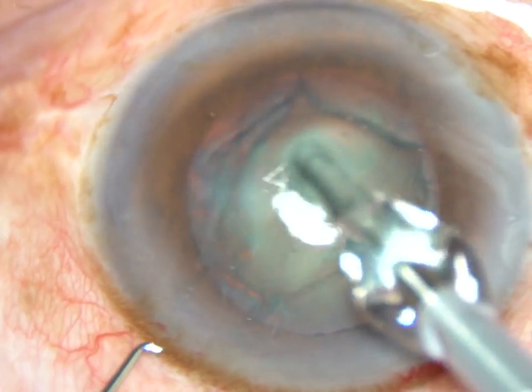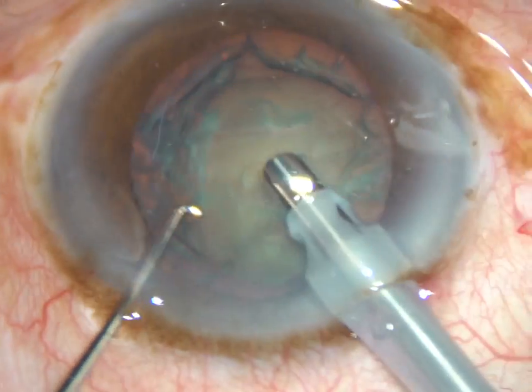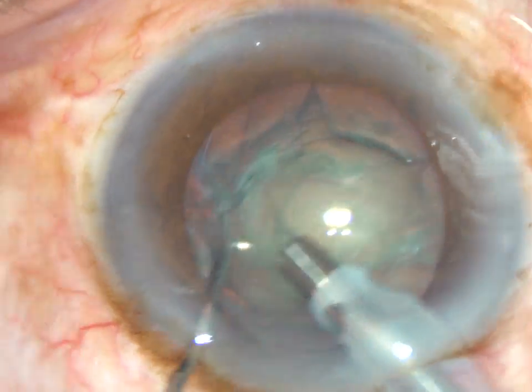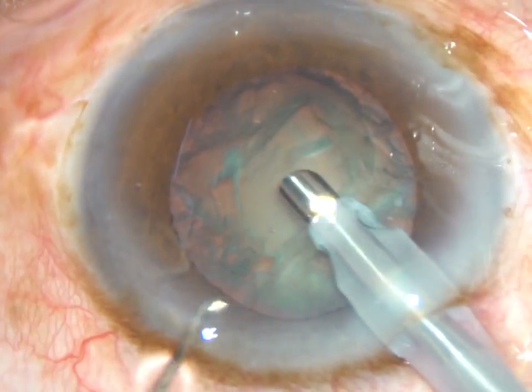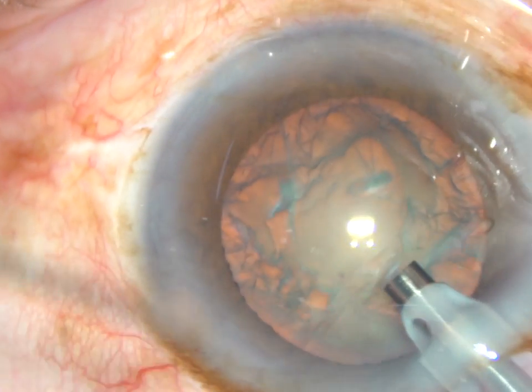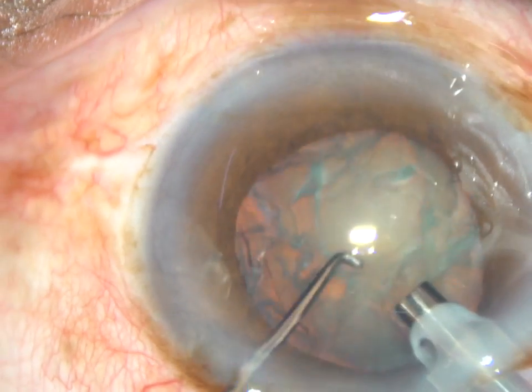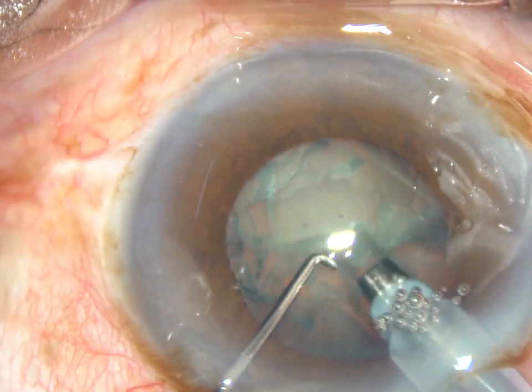Vacuum used is 340 millimeters of mercury. Flow rate is 37 ml per minute and power in this case is 55%. Ultrasonic energy 55%. Here it goes.